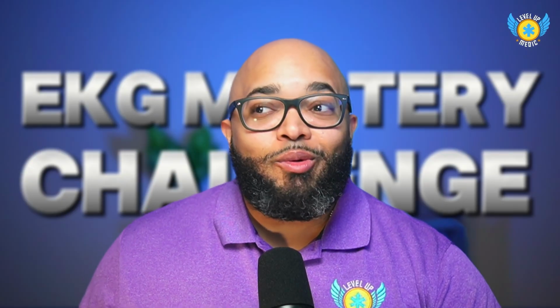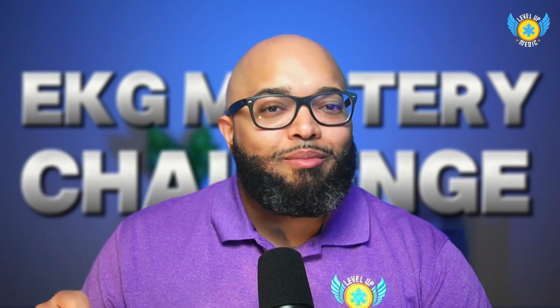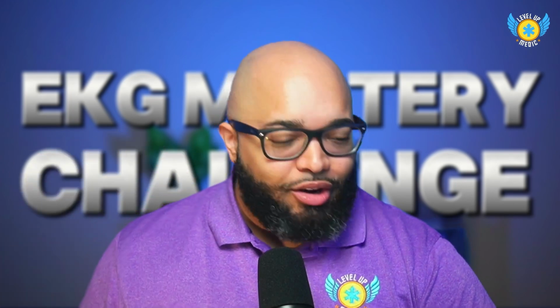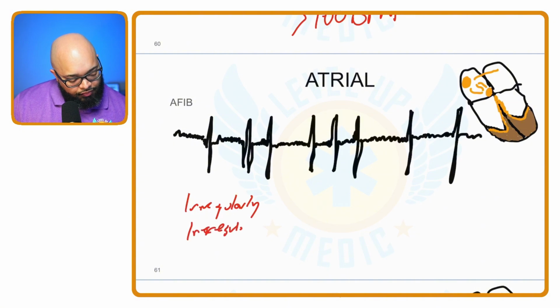All right, so remember, what do we know about a-fib so far? We know that a-fib, b-fib, any kind of fib are irregularly irregular. So let's go ahead and say that. We know that a-fib is irregularly irregular. Okay, just like v-fib. Now, what is a-fib?